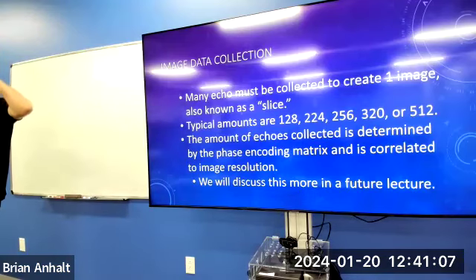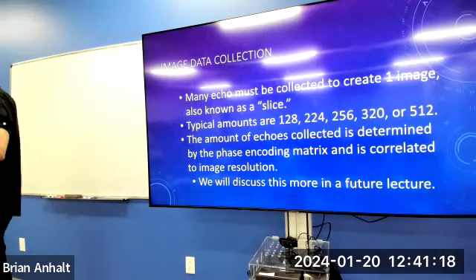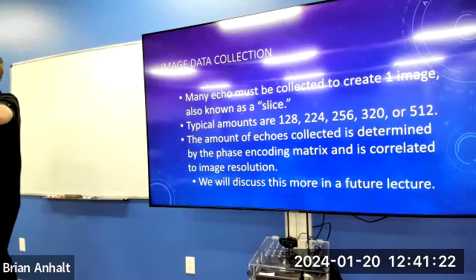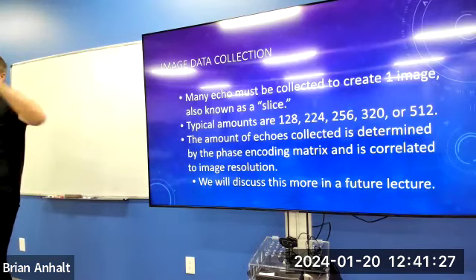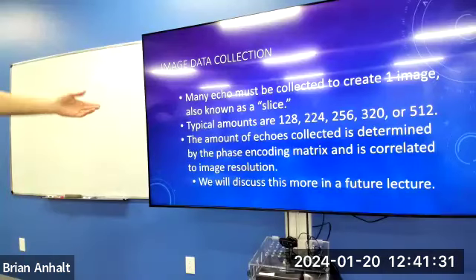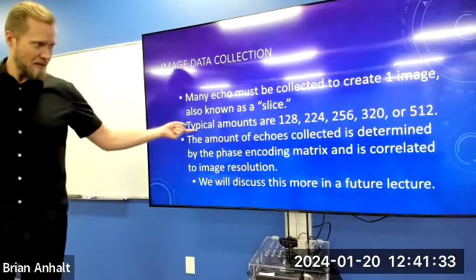But you can see a slice there because when they're cutting it, they're actually cutting slices out of it and it has a thickness. That's literally what we're doing with MRI, except we're not seeing the depth of it. It's all projected onto two planes, but that's how we get the data. We have to excite protons. It has to be 3 dimensions of protons, right? It can't be infinitely thin. You have to be able to excite a thickness of tissue. So that's why they call them slices.